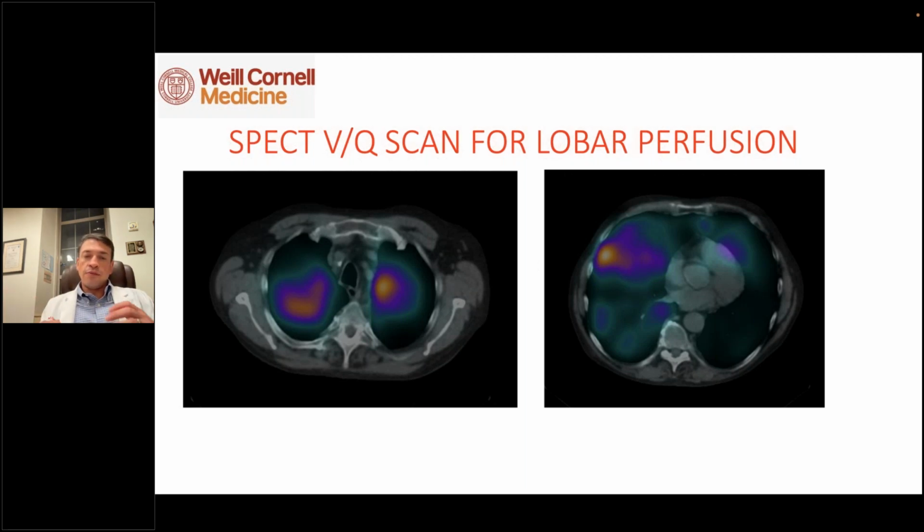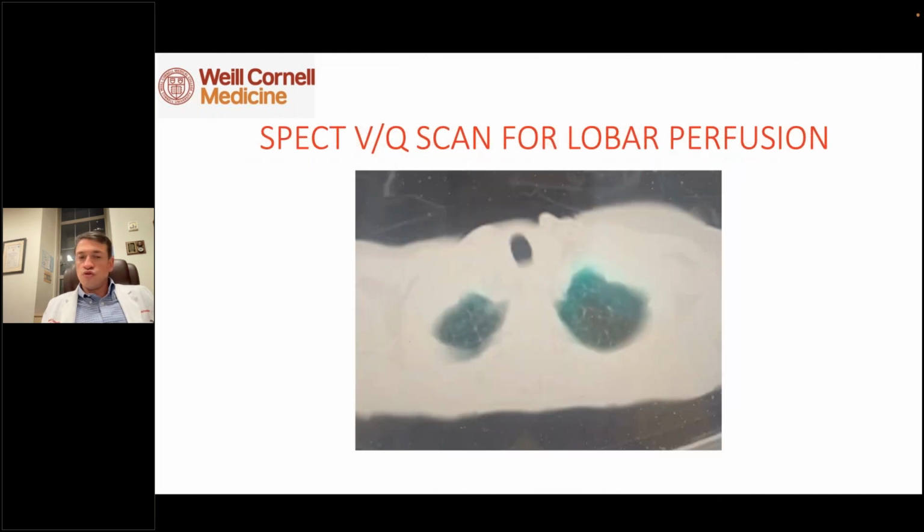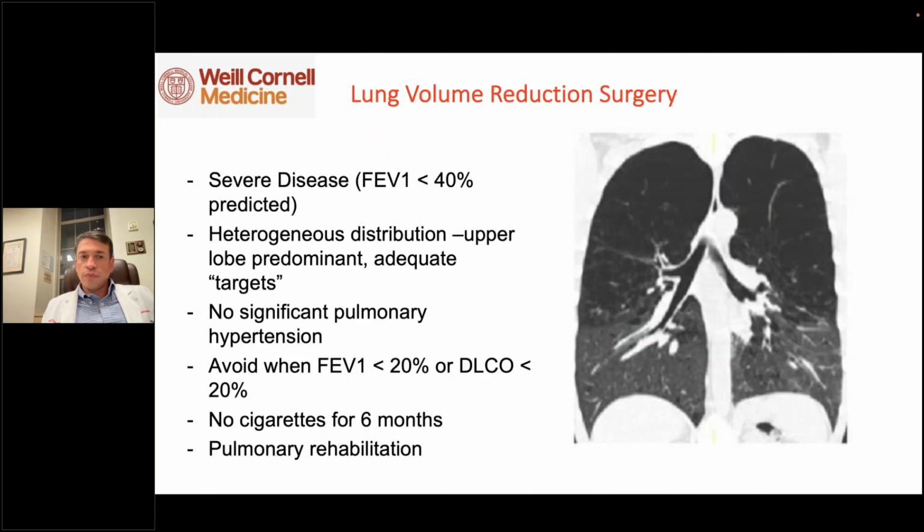And if there is no diagnostic CAT scan, then it becomes much more difficult for them. And we've had many instances of inaccuracies that, when we discuss these cases at our monthly conference, we can catch and correct. So that's just something important. It is not automated, but rather it is a radiologist who has to draw in the fissures.